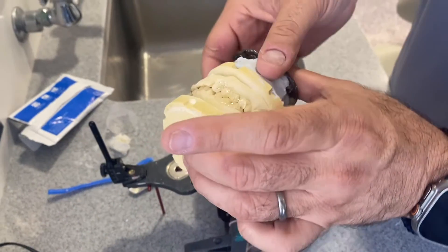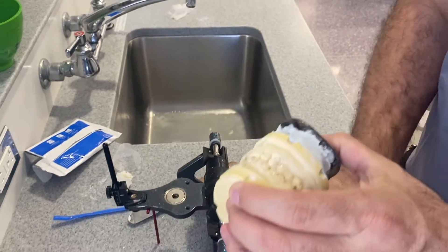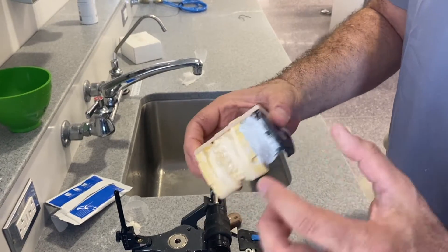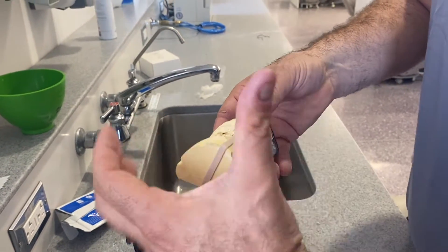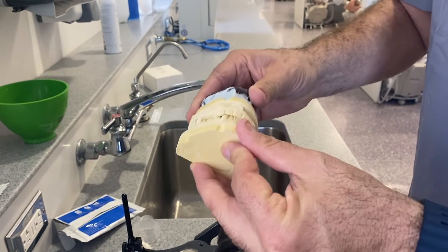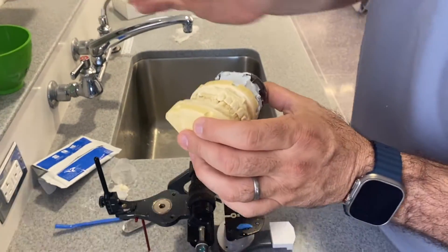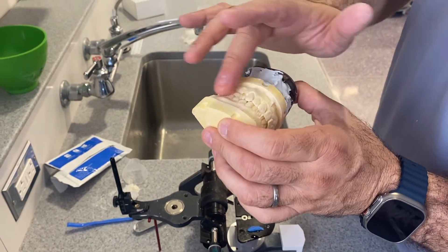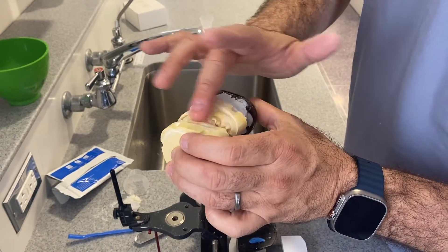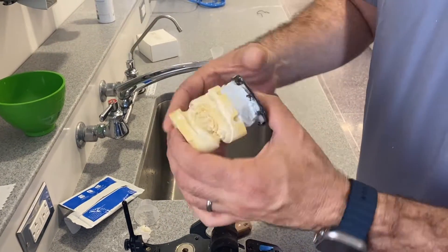Basically, I'm just securing these areas. Some people say to use a rubber band, but I don't like rubber bands because they can move around and give you the wrong result. You have to have the occlusion nice and tight on both sides. You can always wet your finger to speed up the cooling process of the hot glue. Now it's nice and tight.